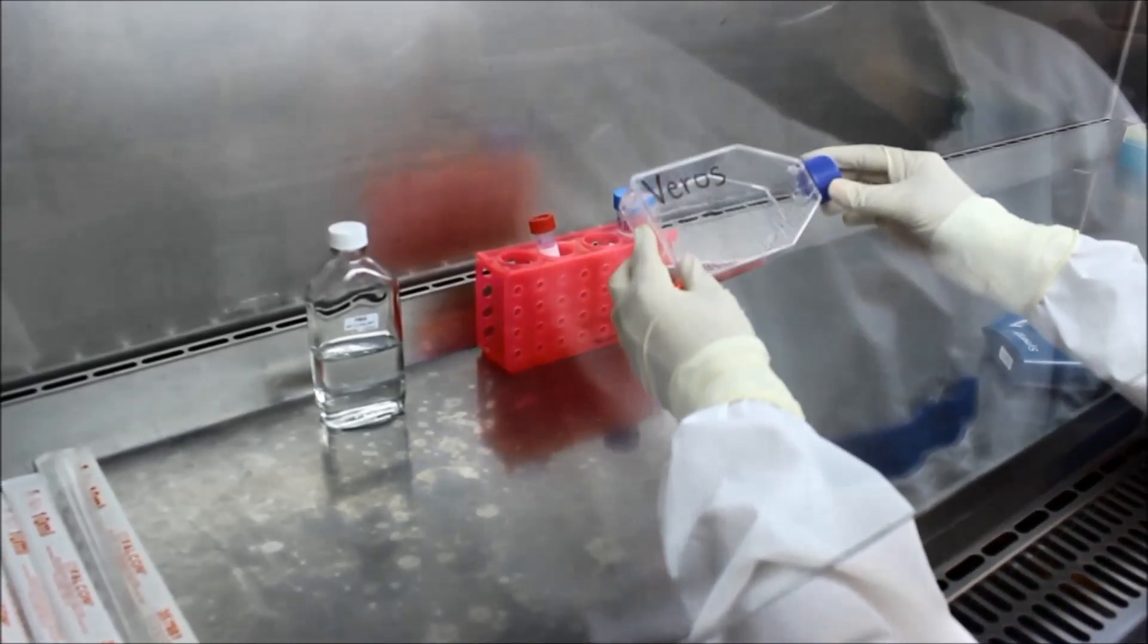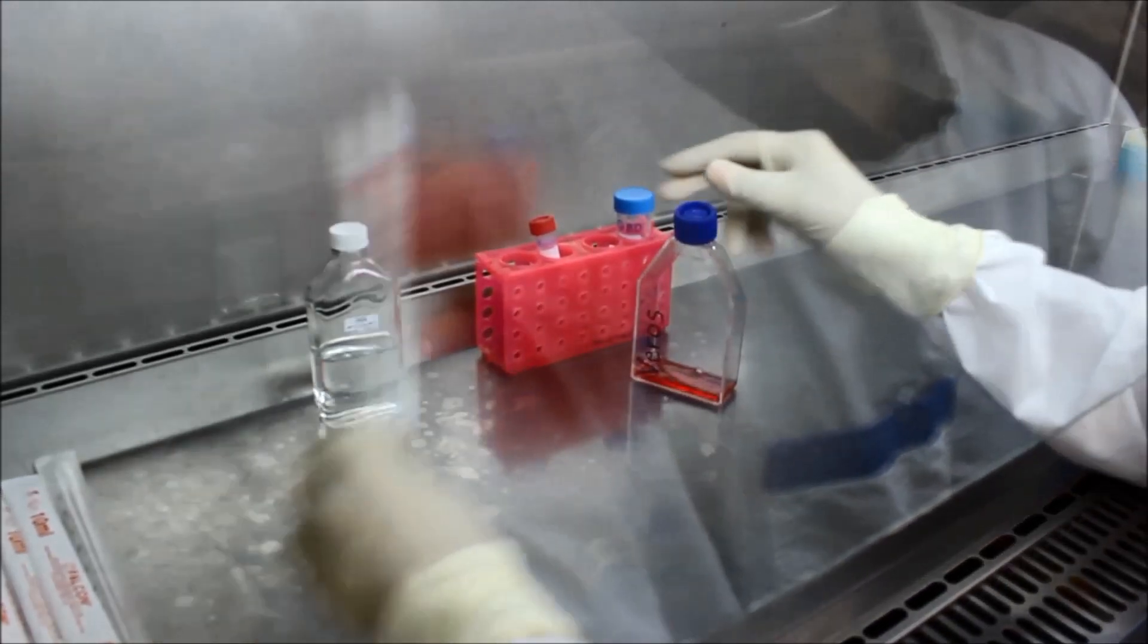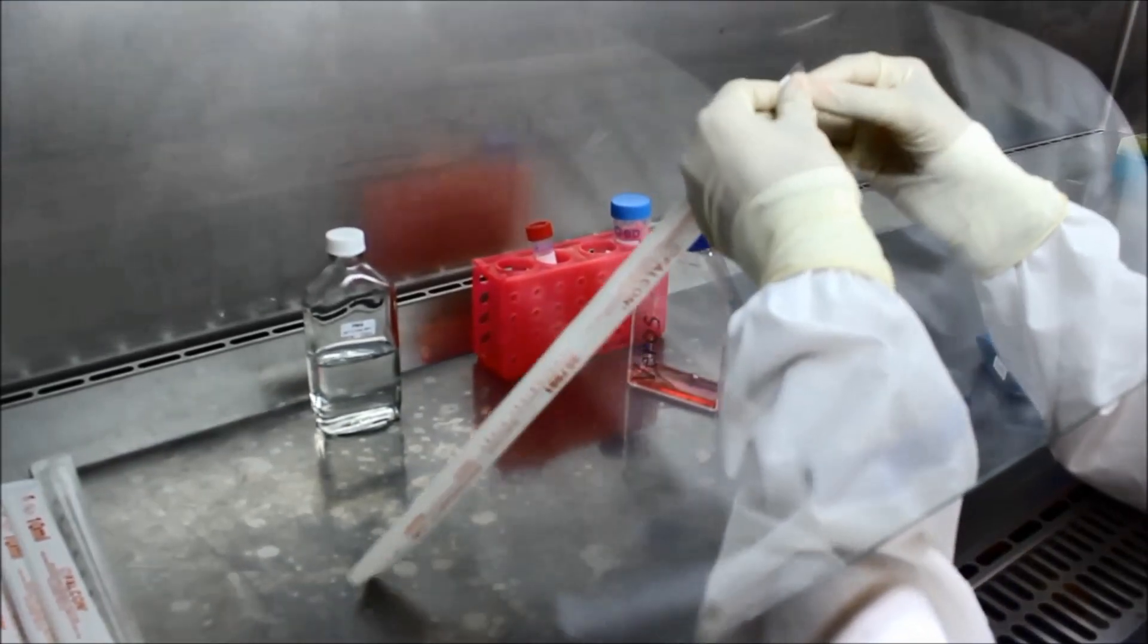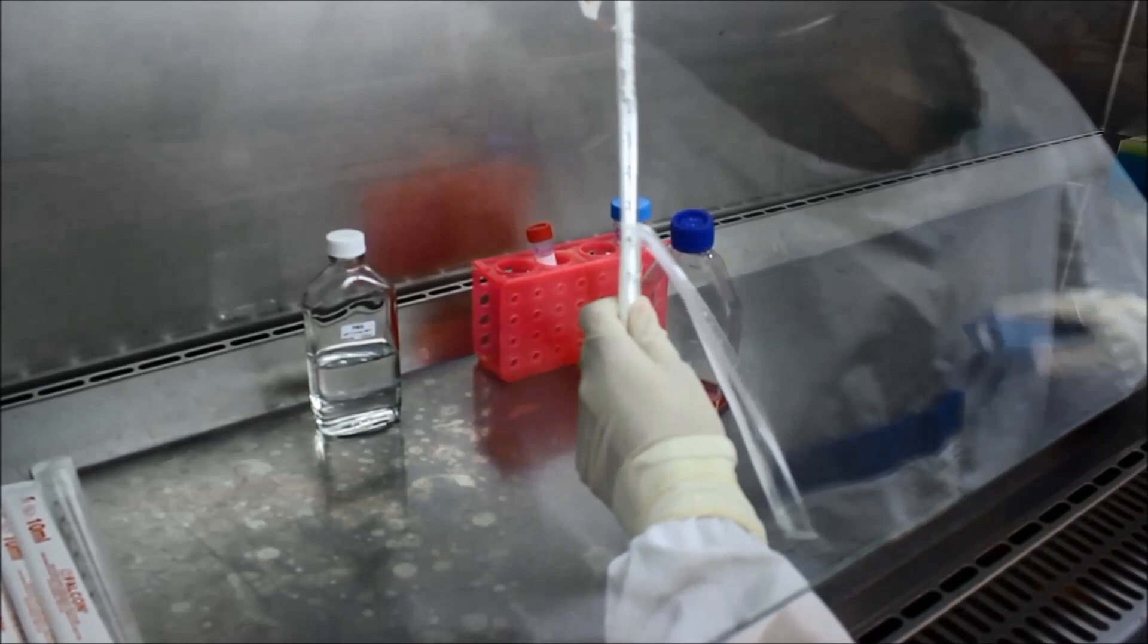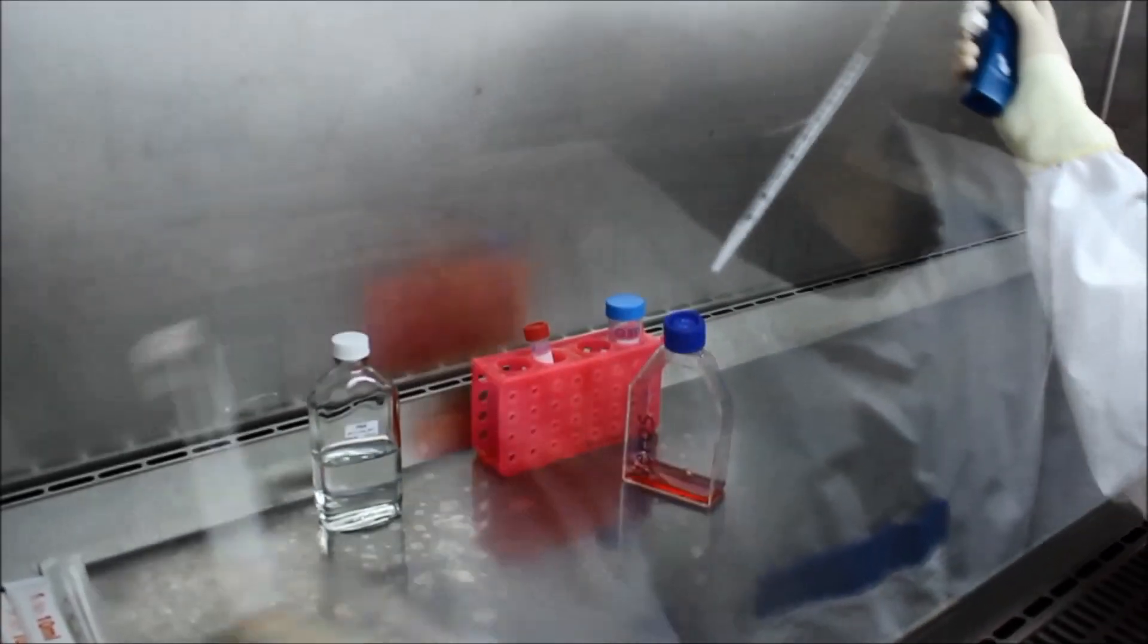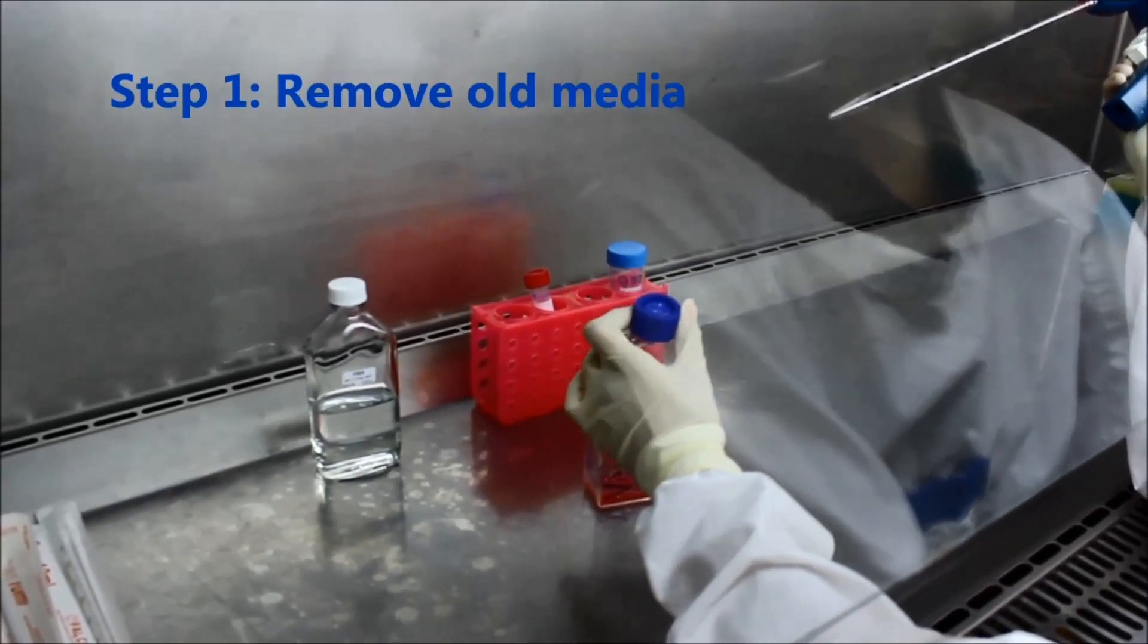Trypsinizing a flask of Vero cells. Remove the old growth medium from the flask, being careful not to drip in the neck. The Vero cells will remain attached to the base of the flask as they are an adherent cell line.